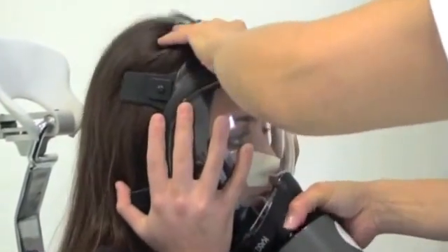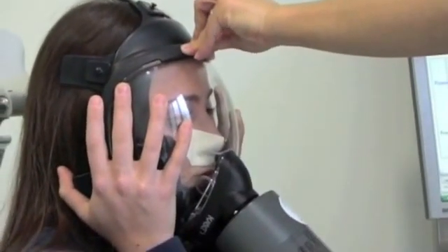Now, the patient is asked to breathe through the nose with the mouth closed.